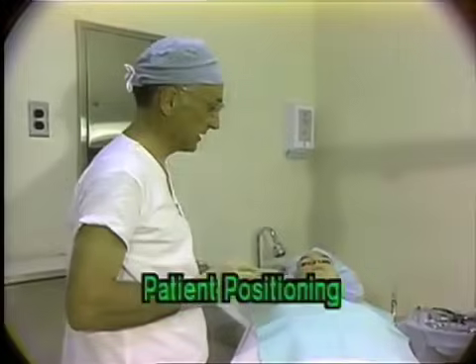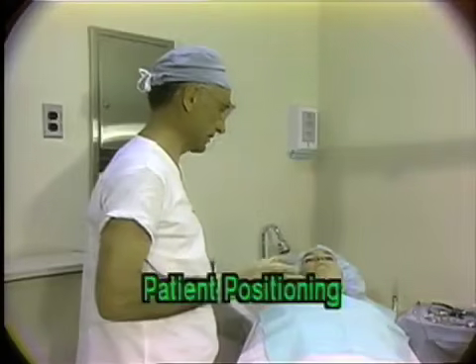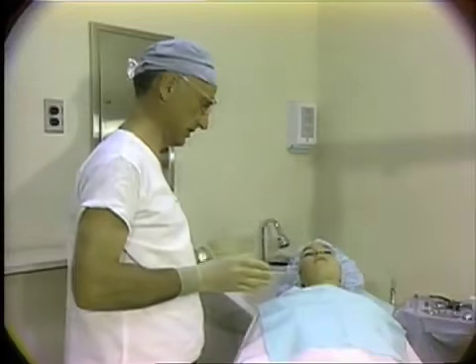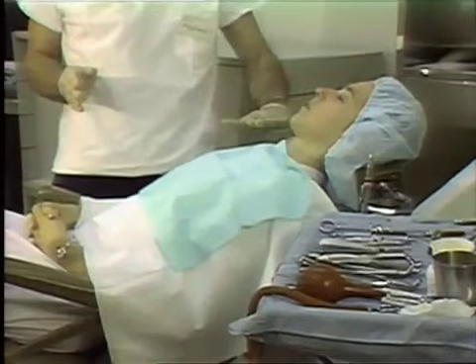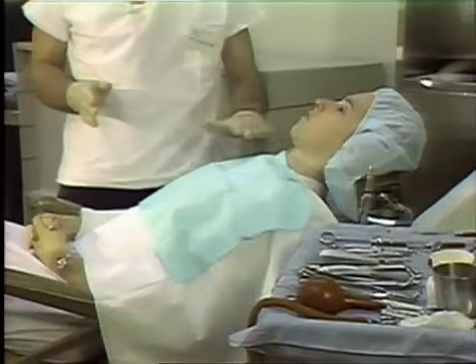In working on the mandibular arch, we would like the patient so positioned that she is comfortable, that the head and cervical spinal column is generally in a comfortable position. When her mouth is open, the mandibular occlusal plane should be horizontal, parallel with the floor.